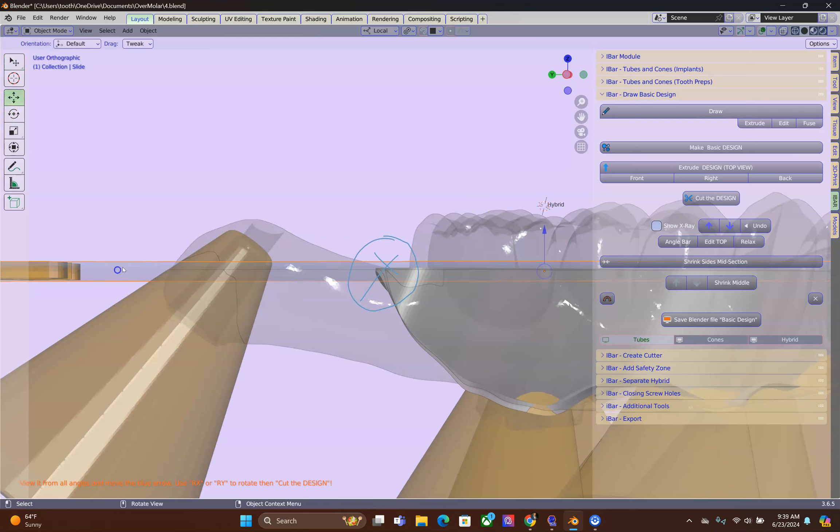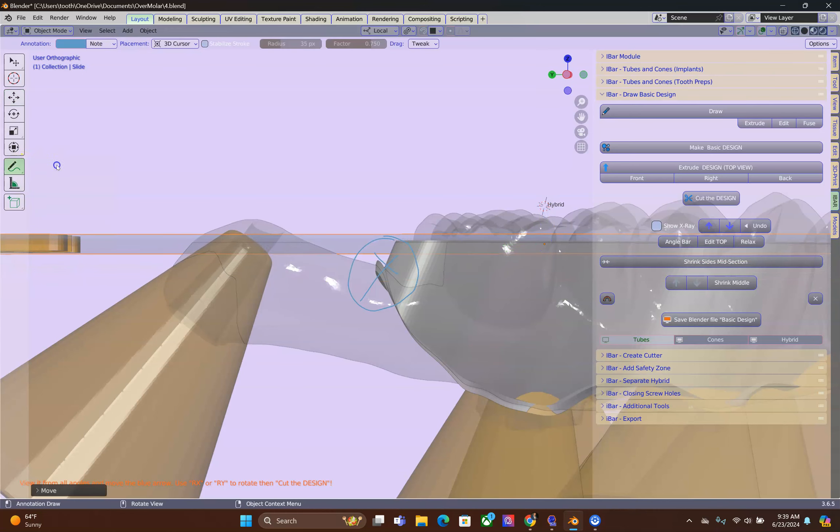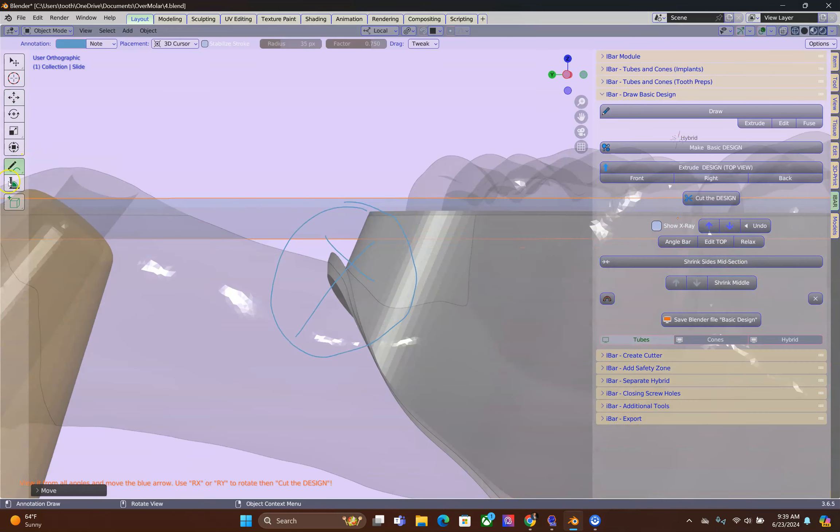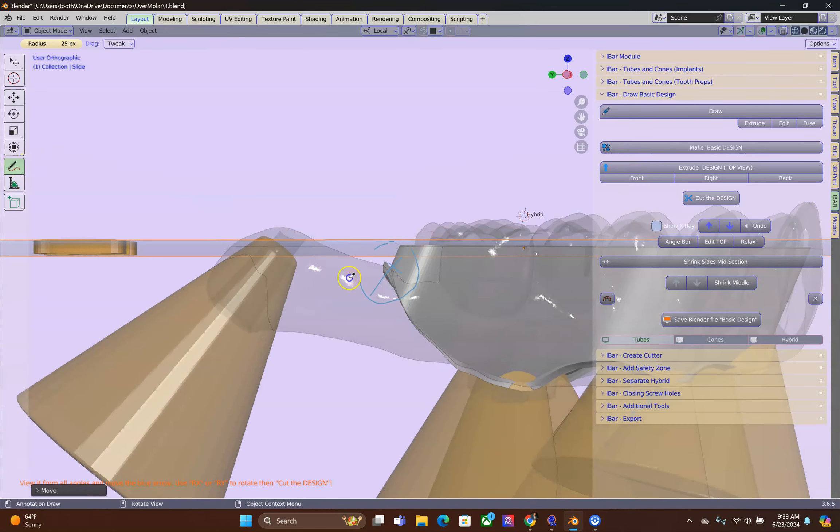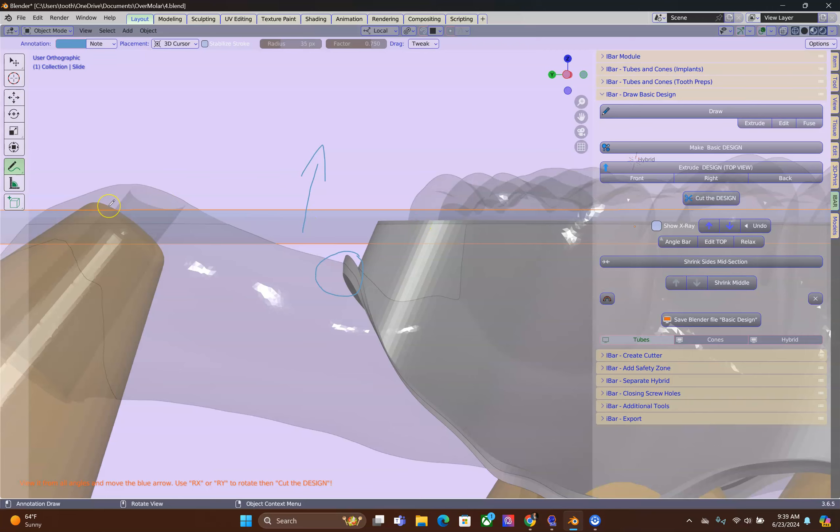We're going to move the cutter up a little bit. Alright, you've got to preserve this area. Always move the cutter a little bit higher. This is correct.